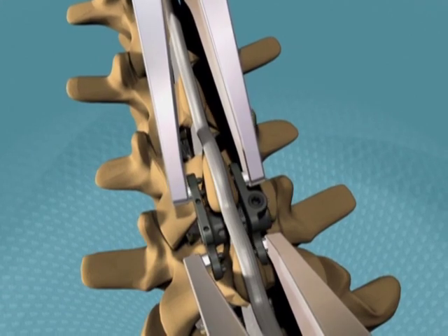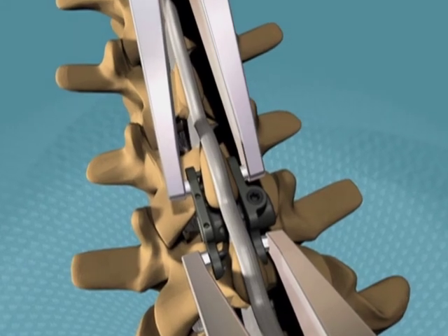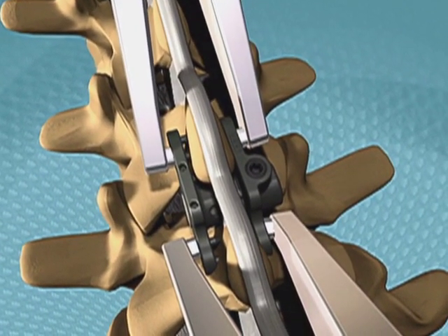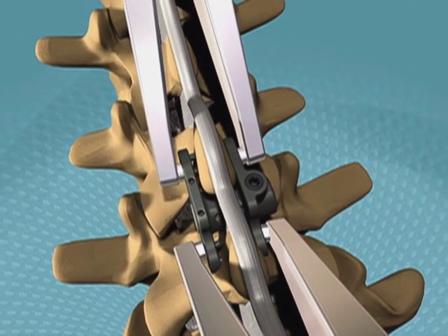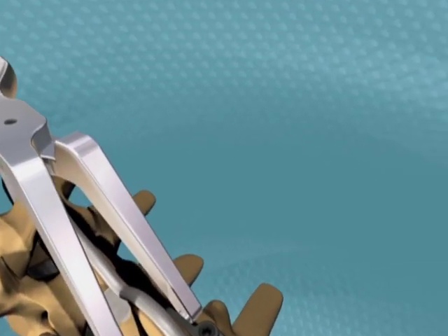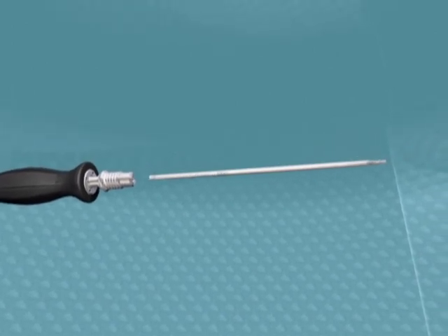Using the compressors, clamp the plates against the spinous processes, driving the spikes into the bone. Squeeze both compressors simultaneously or alternate back and forth to ensure the spikes seat properly in both the inferior and superior spinous processes. Attach the set screwdriver to the 30-inch-pound black torque handle.